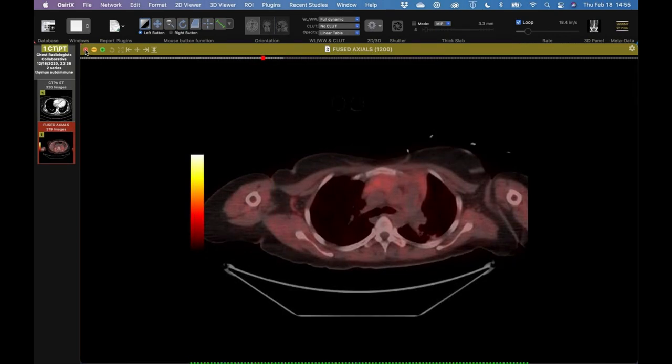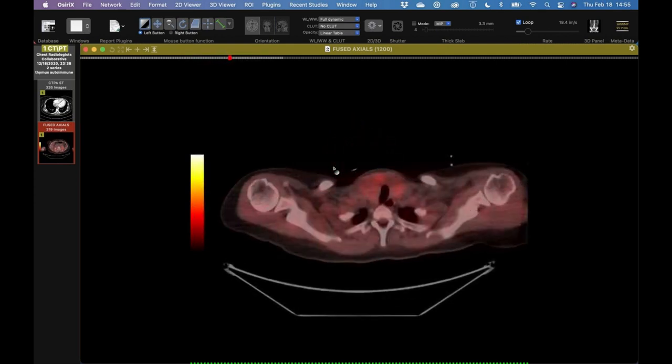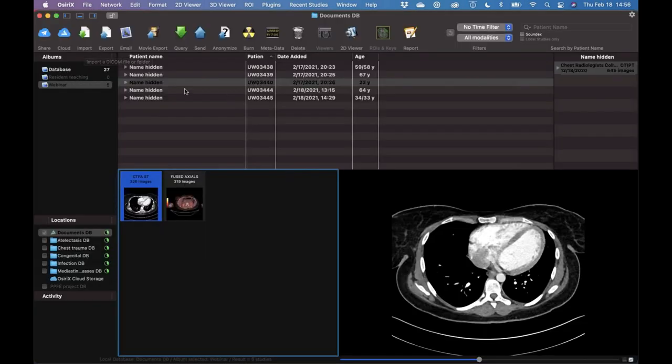We were able to track down some records and lo and behold she has hyperthyroidism, presumably Graves' disease, and is getting ready to start treatment. There is a relationship between autoimmune thyroid disease and thymic hyperplasia. I think this is a case of thymic hyperplasia — whether it's lymphoid hyperplasia or true hyperplasia, I don't know. I don't think we'll ever know, and I don't think a biopsy is indicated. You could almost make the diagnosis of Graves' disease based on the CT with the thymic hyperplasia. It's not just Graves' disease, but also Hashimoto's.